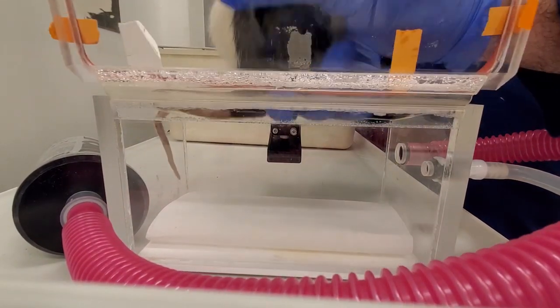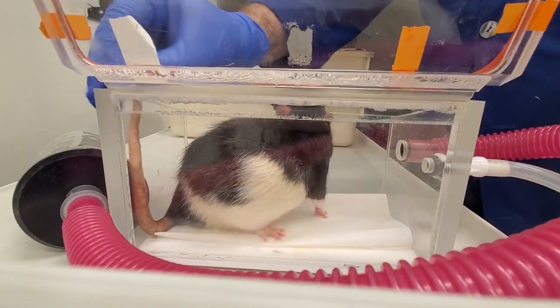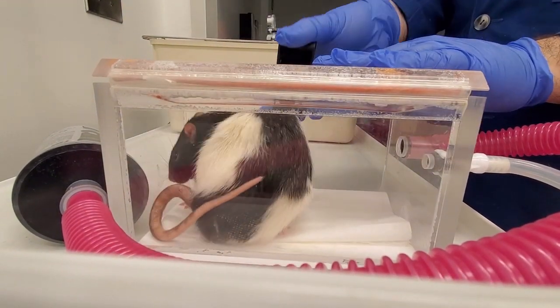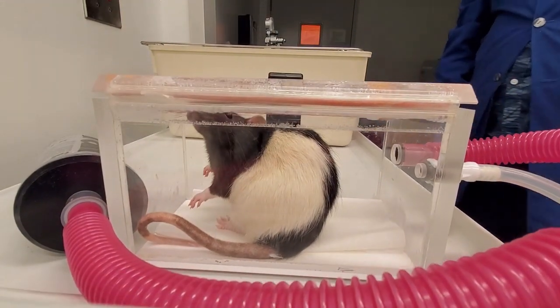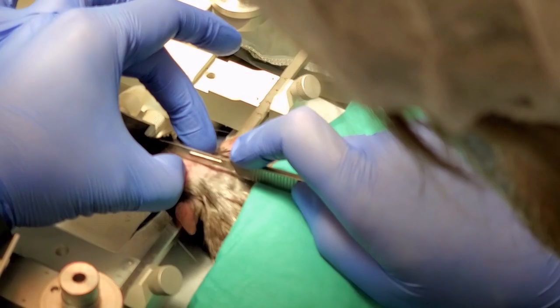Once anesthetized, they're weighed, the head is shaved and cleaned, and the rat is given an injection of analgesic. After this, the rat is placed in the stereotactic frame, which allows us to maintain the anesthesia by delivering isoflurane, and it keeps their head level and immobile during surgery.